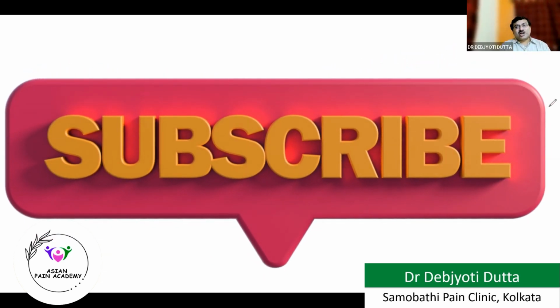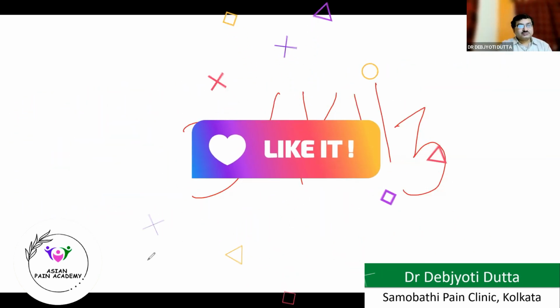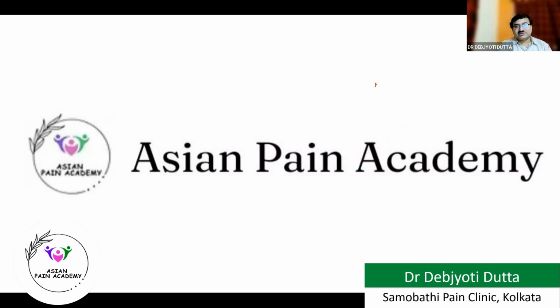Can anyone tell any other example of using the same machinery to generate heat with the help of radio frequency current? A machine that generates heat: the cautery. Yes, cautery actually works on the same principle of radio frequency. But the big difference is that in radio frequency we raise the temperature close to the nerve in a controlled and sophisticated way. The cautery raises the temperature at a very high rate, causing shedding of the tissues, boiling of the tissues, protein degeneration, everything. Our lesion will be controlled, of a specific size, and very close to a nerve, to a specific area. So that is the basic difference. But by principle, the machines are not different.